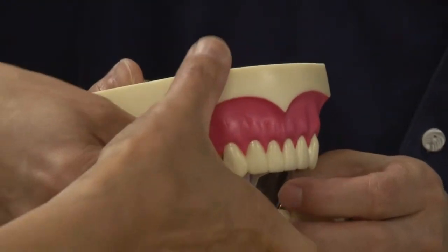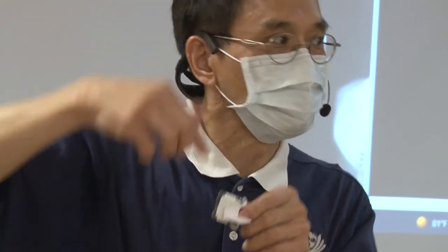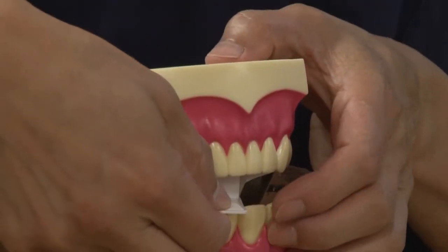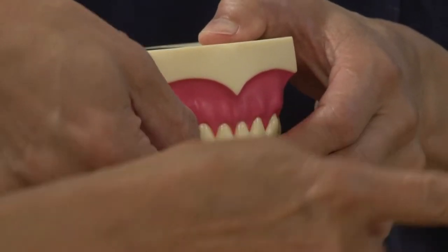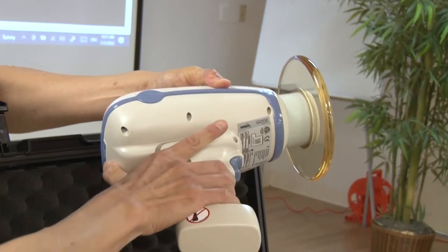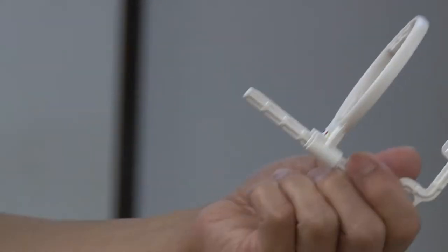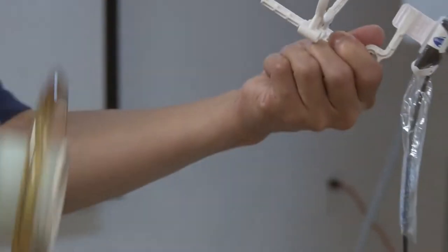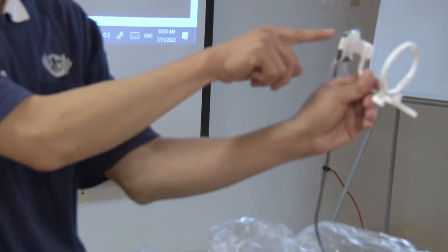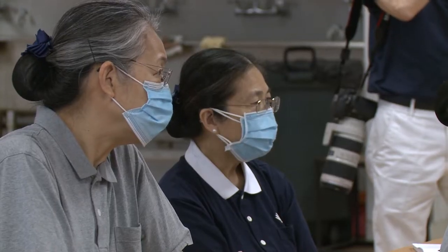Because you have to put this one inside the mouth, behind the teeth. Then you ask the patient to bite, right, and then hold up. Okay, X-ray. This is very simple, you just need to click. Okay, that's almost ready. So the gum will be using this way, so they can touch the sensor. In the teeth, you see the patient, and sometimes we put this one.